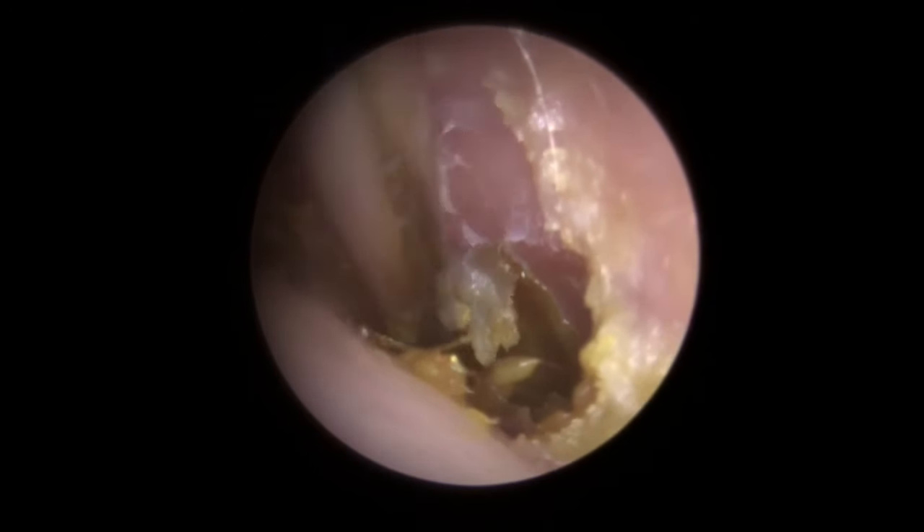This gentleman, if you remember, had some grommets fitted in the past, which means there is more than likely going to be some scar tissue left on this eardrum — and that scar tissue can form really thinly. So I'm going to try and get away as much of the looser debris as I can. He's going to oil this up for another week and come back and see us. But we have uncovered the majority of the eardrum. Patient much, much happier, really hearing well when he left. We did really try to get this away, but you'll see what I mean about that flexion — there's a little bit of movement to the eardrum underneath.